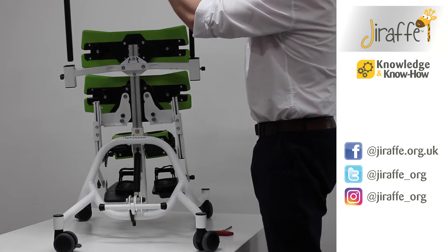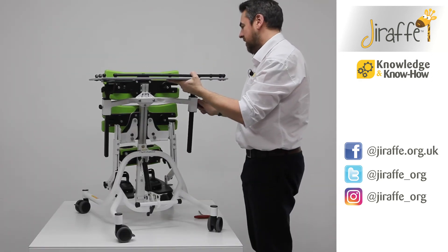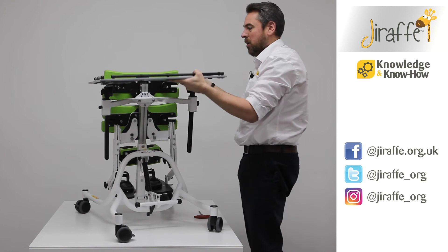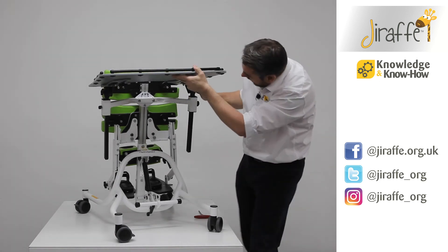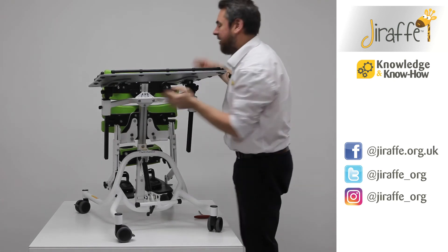We're going to feed the tray into those tray support channels and bring it down to the desired height, then use the wing knobs on the side to lock off the height. Then we're going to set the angle of the tray based against the angle of the main board and use our large wing knobs to fix those into place.